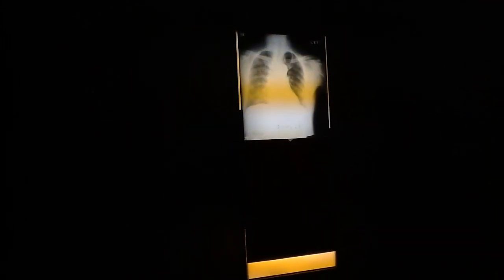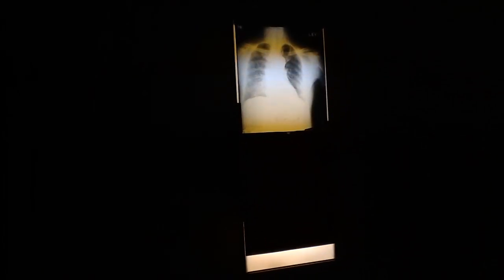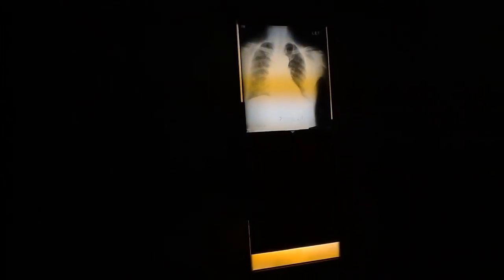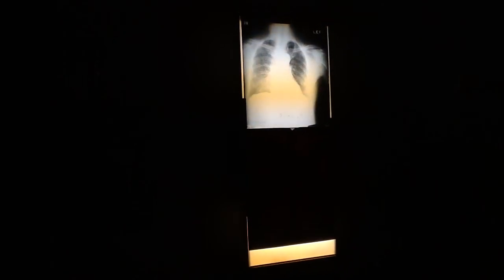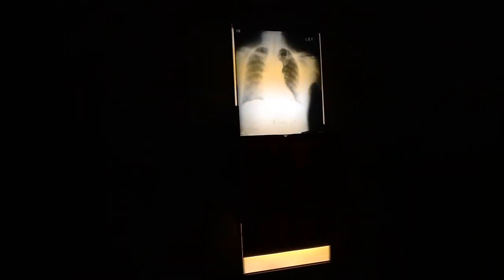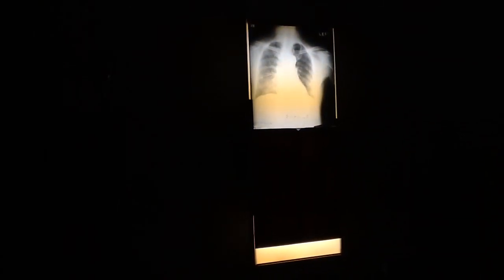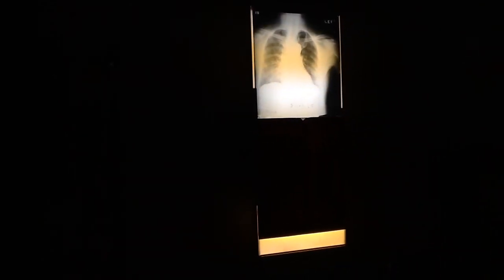This was a patient with tuberculosis, but there's no way to know that just from looking at the x-ray. But this could be viral or mycoplasmal pneumonia. This could also be sarcoidosis. Sarcoid can be reticular, sarcoid can be airspace, sarcoid can be miliary nodular. Without a history, chest is so history dependent compared to bone and joint. This was TB. And we'll talk about miliary TB.